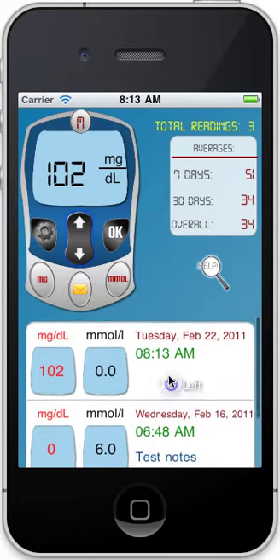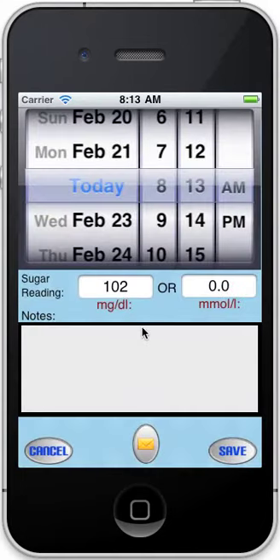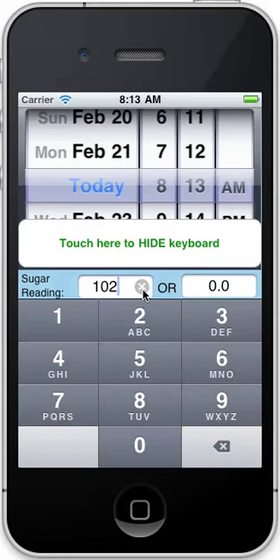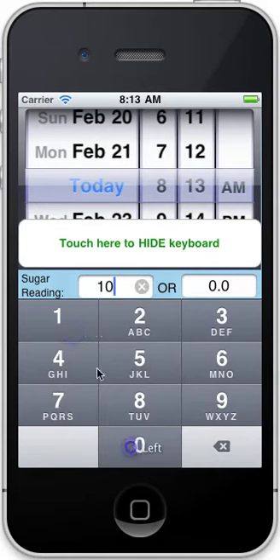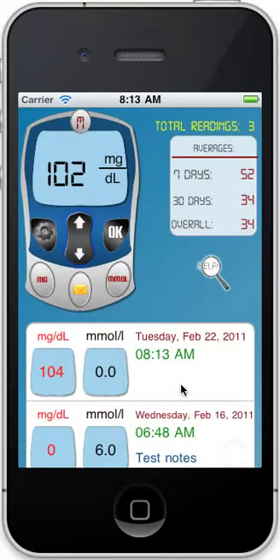Let's say I made a mistake and I want to edit this reading. I can just click on the reading and change it. Let's say I want it to be 104 instead, and then I can hide the keyboard and click Save — and there it is.